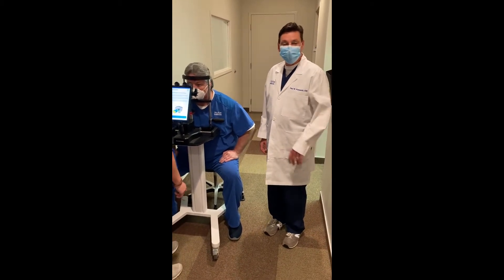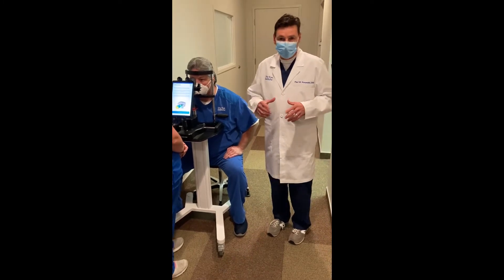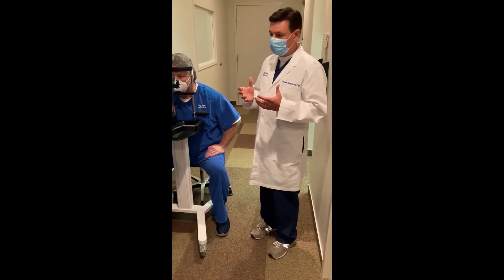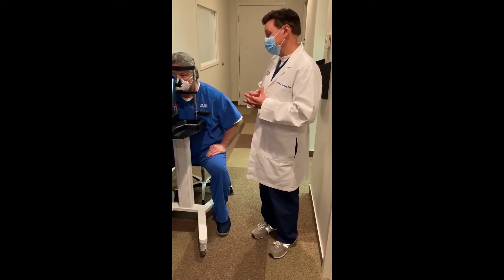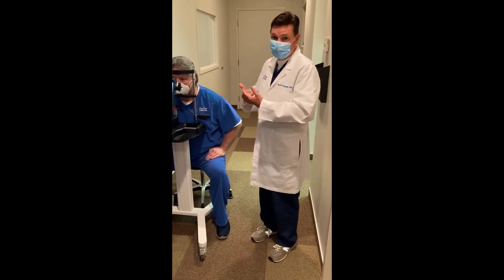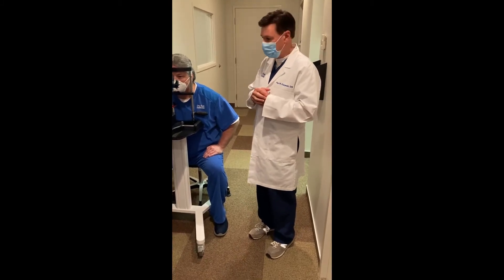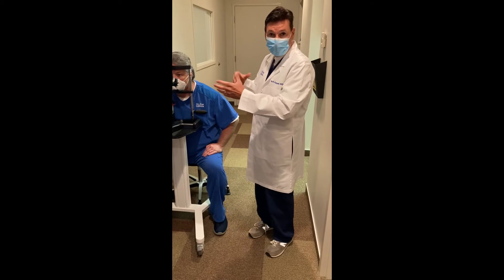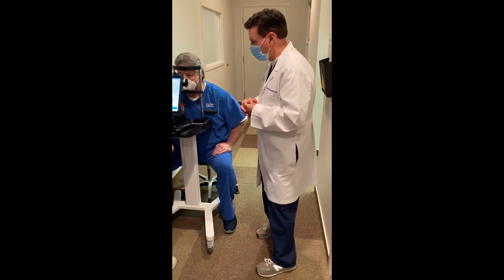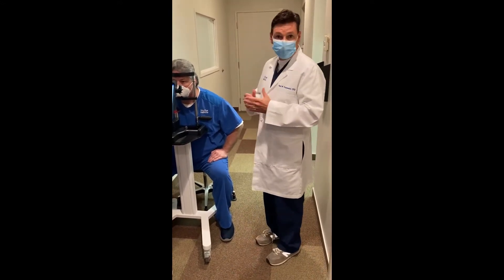Hello, I'm Dr. Paul Karpecki. Today I'm going to take you through a technology I'm extremely excited about known as the MECHECK. It's a wonderful meibography system that's very simple, but also a great patient education tool. Beyond that, it also does not only meibography — it takes into account the data, allows us to do a symptom score on the OSDI-6, which gives us key symptoms related to dry eye, and allows us to educate the patient and give a grading of where they're at based on the Pult score — the meiboscale as it's listed here. Dr. Pult has done a lot of the work in creating and validating it, and we're lucky to present this today.